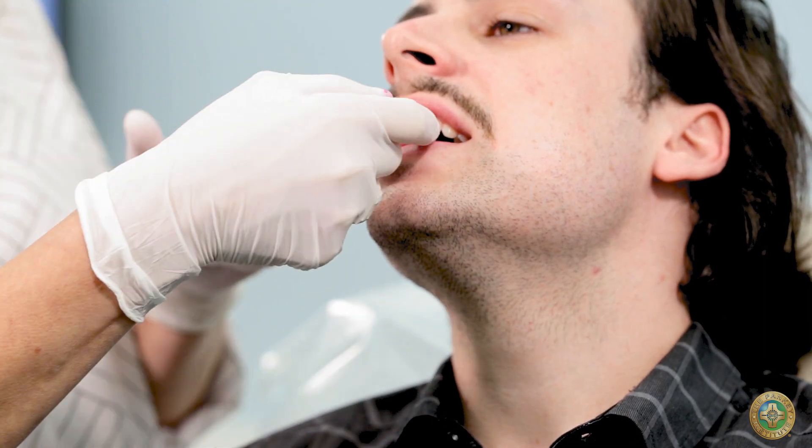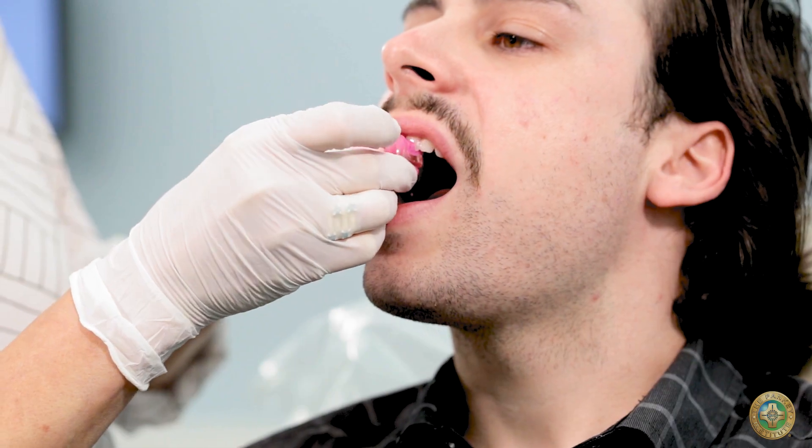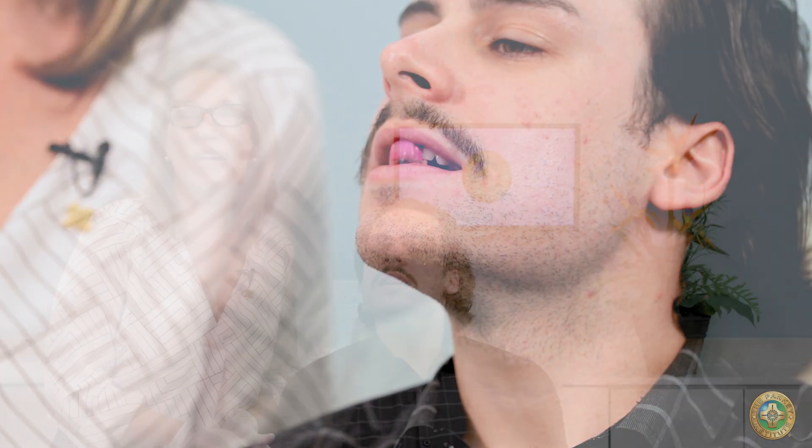All right, now our material is set. Go ahead and open, and I'm just going to pop this off of his teeth. Using a Bard Parker, we're just going to trim away the excess material that's gone out past the Bite Stop. Now we have our device — it simply fits back over Dylan's two front teeth. We would set a timer for 15 minutes and allow his muscles to relax so that we could either take our Centric Relation Bite Records, assess whether there's an improvement in his muscle discomfort on palpation, or see if an anterior-only device like this would actually help alleviate acute symptoms.